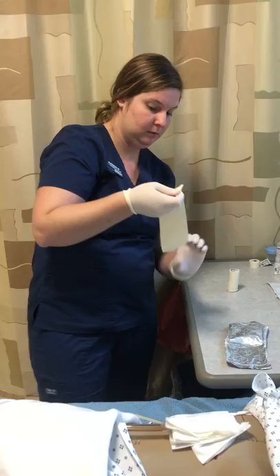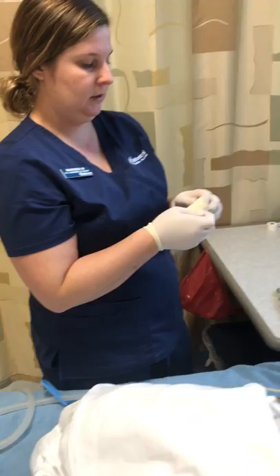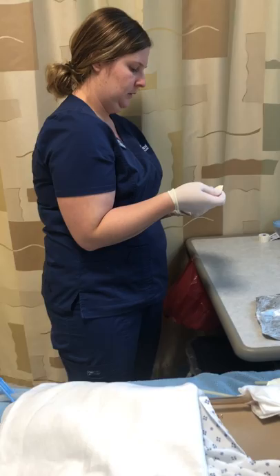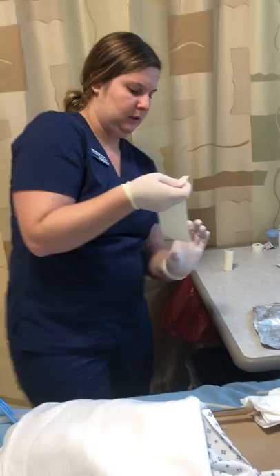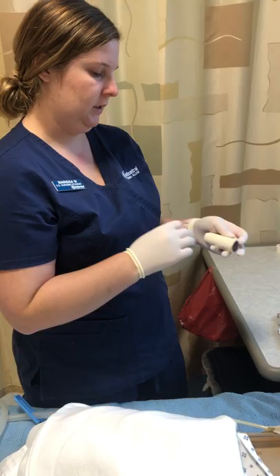I'm going to pull tight, put one on, and do my next one. Good stick. Again, not touching the center, just the edges. I'm going to put my second piece of tape down. And then I'm going to do my last piece here.